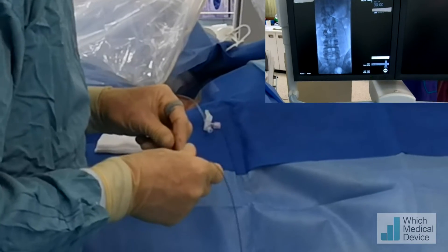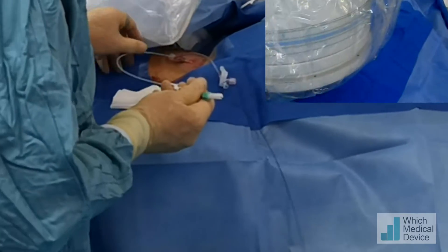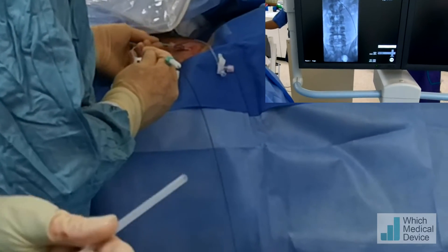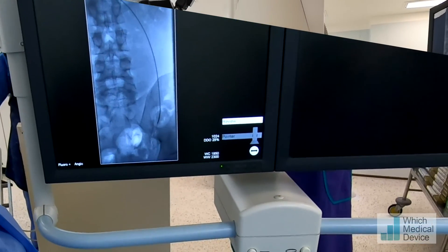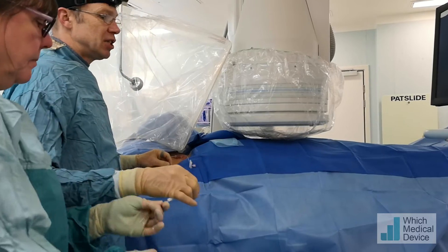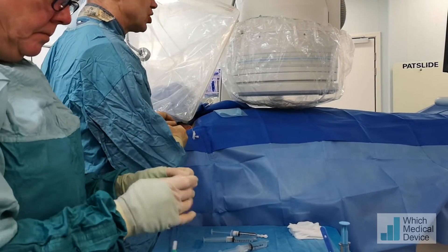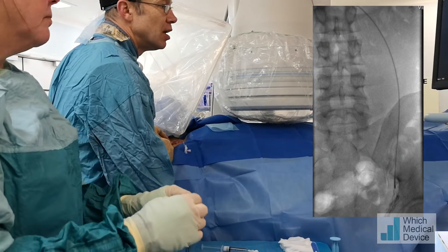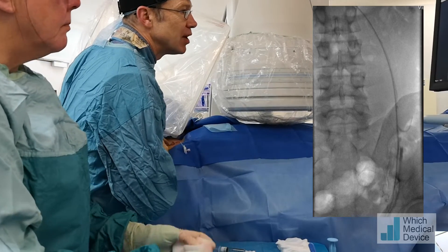Every time it stops, I'm just redirecting it because it's probably gone into a small side branch. And it's gone down very easily there. We're now going to advance the multi-purpose catheter down with a slight rotation, just to take it round the corner and down the gonadal vein. I'm advancing my wire a little bit further, down to the level of the internal ring, and then take the wire out. I'm now going to inject a little bit of contrast and check the size of the vein and exactly where we are. We're in a small branch of the gonadal vein, so we're just going to pull back until we get back into the main gonadal vein.